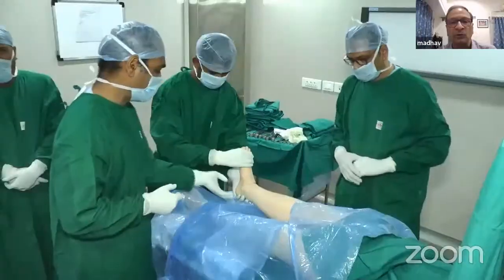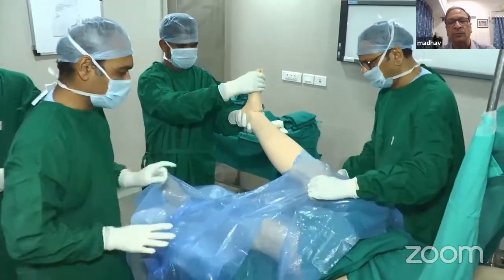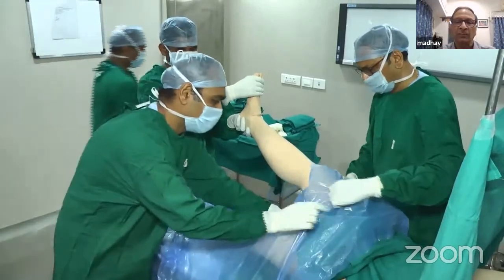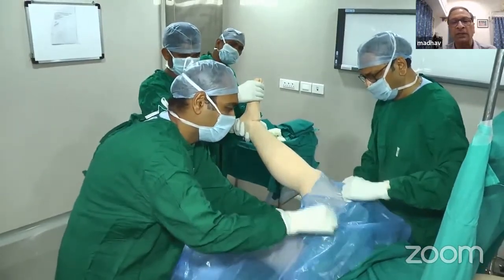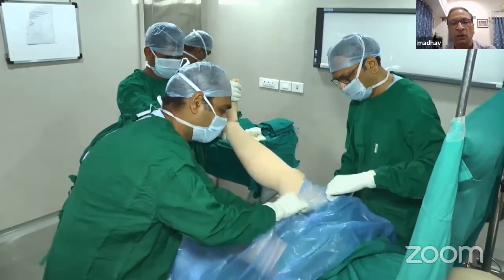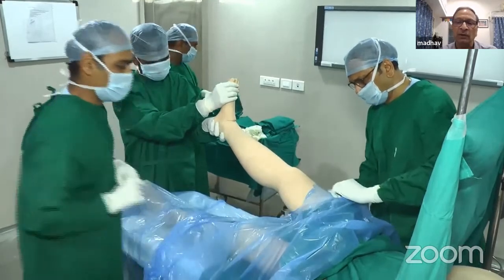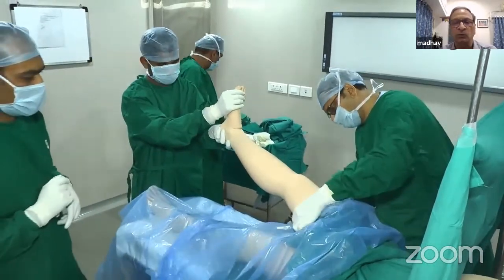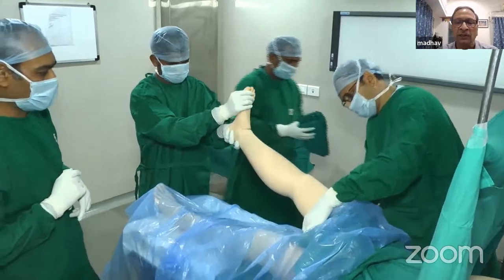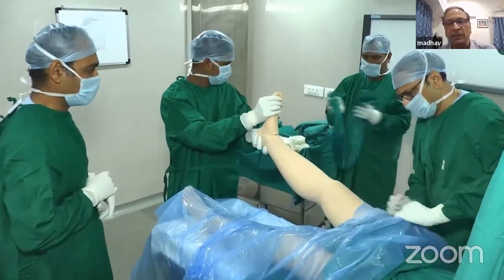So here I am showing you the video for below the knee surgery, or below knee draping; you go only up to the knee. If you want to keep the knee also open, or you are doing some procedure on the lower thigh or the knee, then you keep on pulling on the plastic sheet. It goes on tearing and goes right up to the upper third of the thigh where the tourniquet is applied.